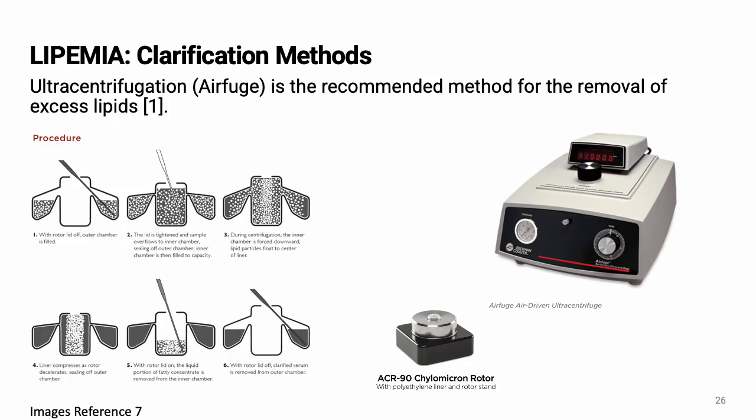Ideally, to avoid lipemia, specimens should be collected from fasting patients. However, this is not always possible. And as I mentioned previously, some individuals may have medical conditions in which lipemia may be present despite fasting. The recommended method of clarifying a lipemic specimen is ultracentrifugation.